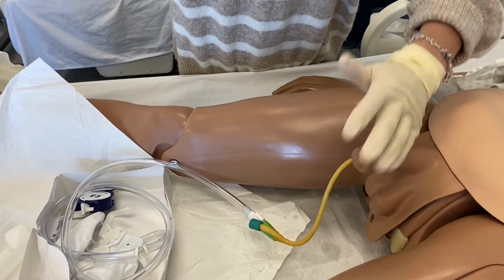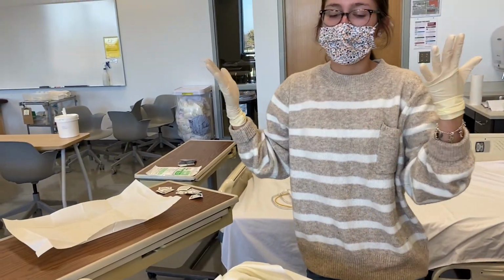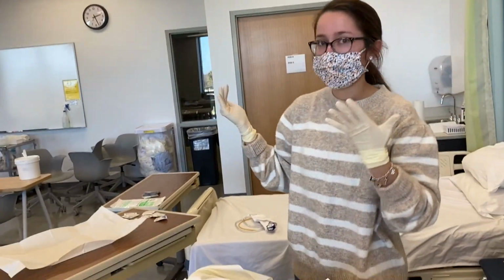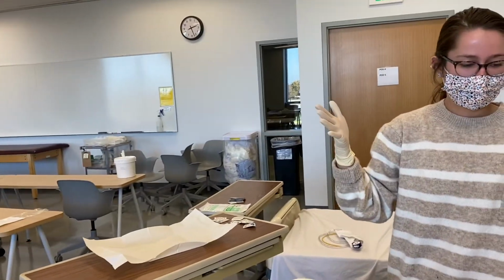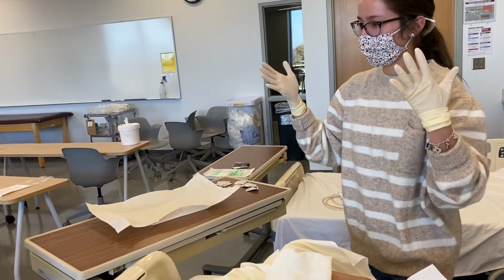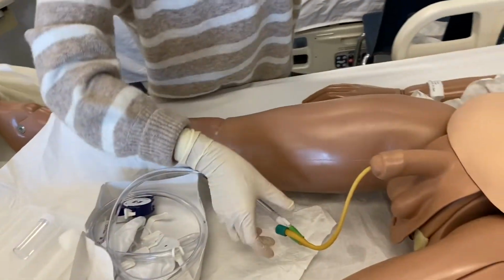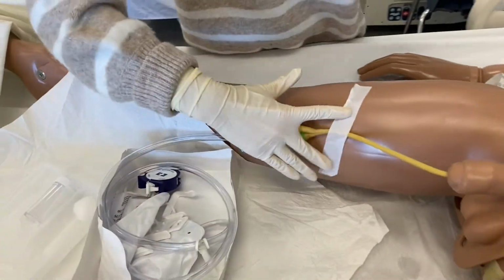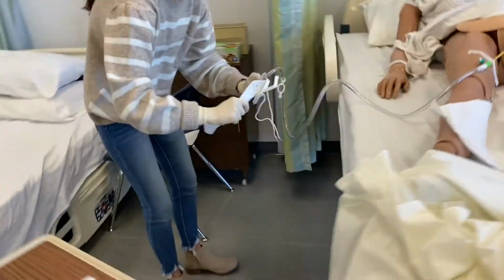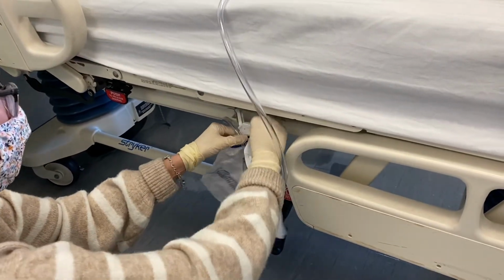Okay. And then going to get a piece of tape. In real life, I would have tape already by me and ready. My assistant has to go get me some tape. Thank you. So I would tape this to his inner thigh, like so. Then I'm going to bring his bladder bag down and let gravity help us. I'm going to put it right in here.